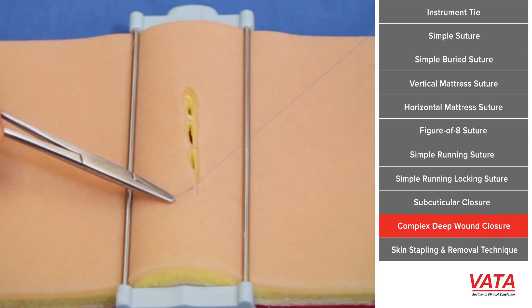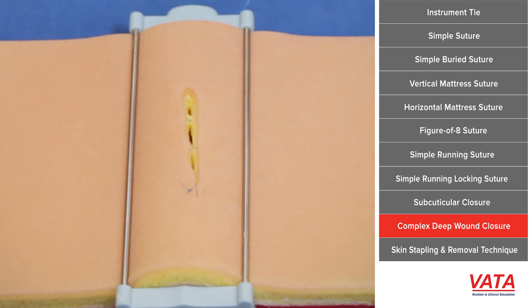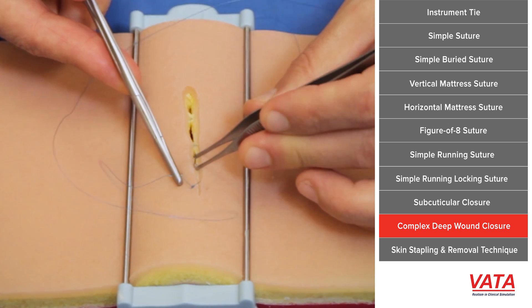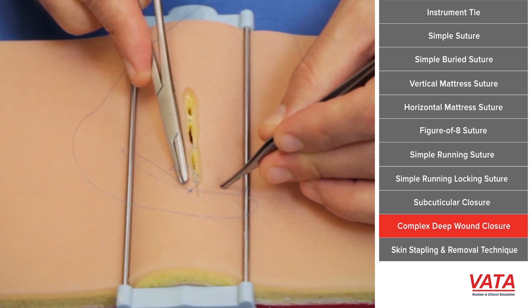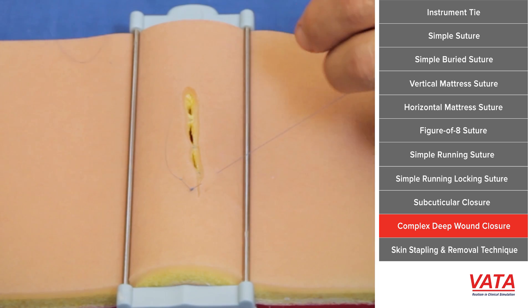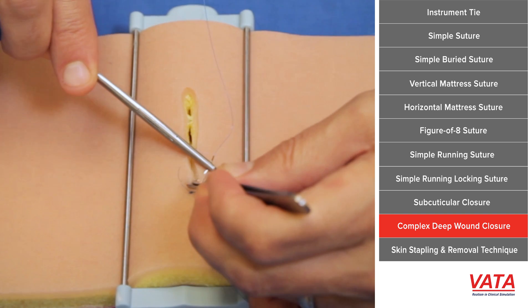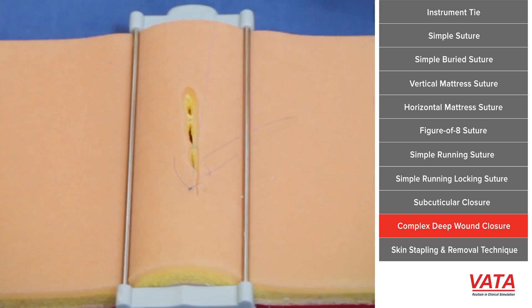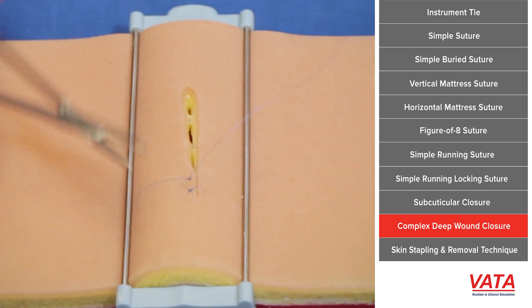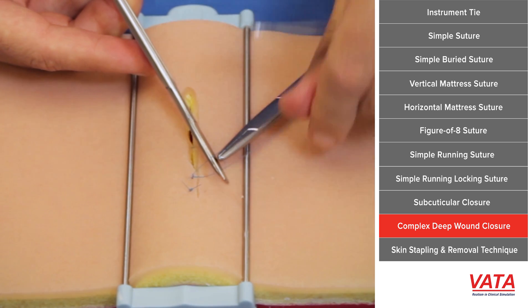Now we have the dermis closed, so now we're going to do our skin closure. This is your closure of choice — you can do a running suture or interrupted. Because this is a complex closure under a lot of tension, I'm using the vertical mattress. This is probably the best suture for wounds that are difficult to close and under a lot of tension, because you're grabbing a lot of tissue, starting far away, and your second bite is close. When you tie it, it literally everts the wound — the skin edges pout out — which gives you proper healing. If you don't place your sutures properly, the skin can turn in, and epidermis touching epidermis is not going to heal. You'll take your stitches out, your wound will break open, and it's because you didn't approximate your edges.